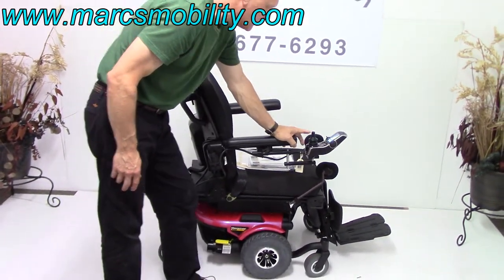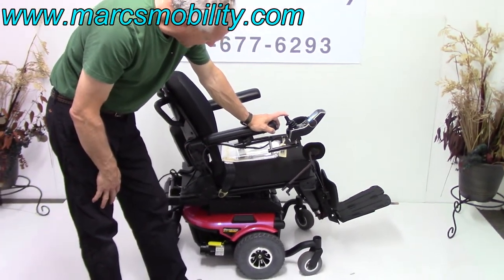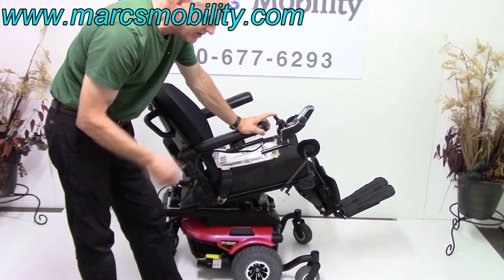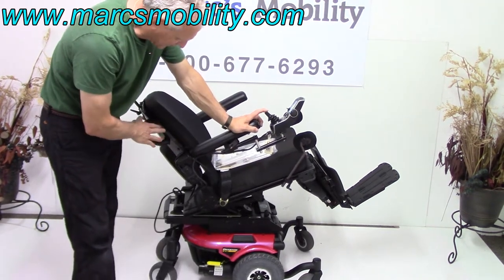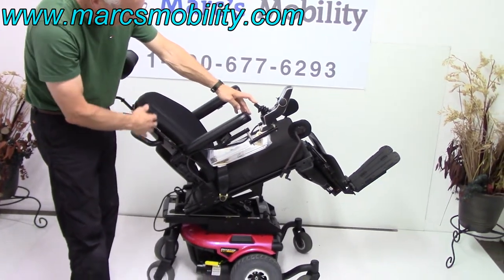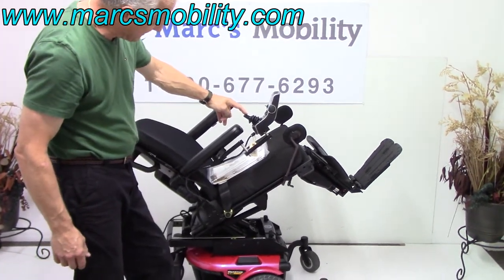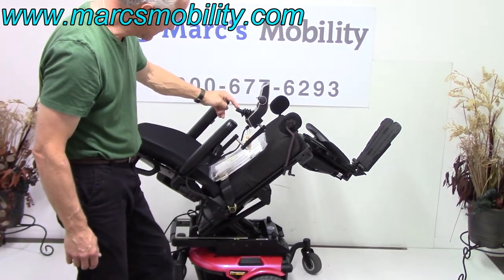The next thing I'm going to show you is the electric tilt. This would be the electric tilt going back now — see how quiet that is? So if you're looking for a chair for your house and you need tilt, seat lift, and electric legs — there's no electric recline here, so your back always stays unless you tilt it. This is called a full electric tilt.